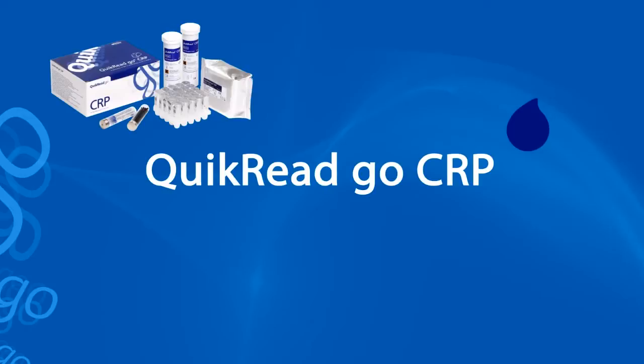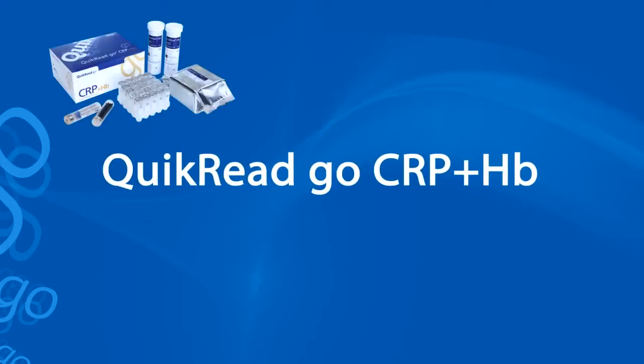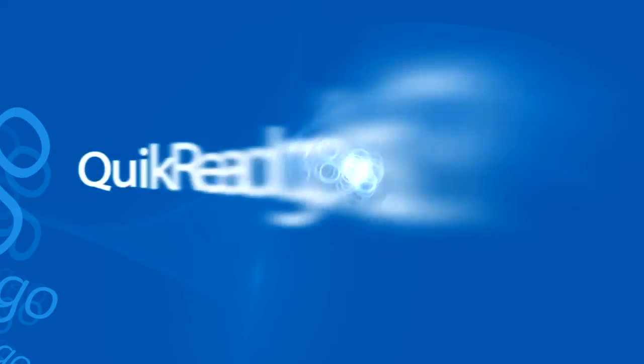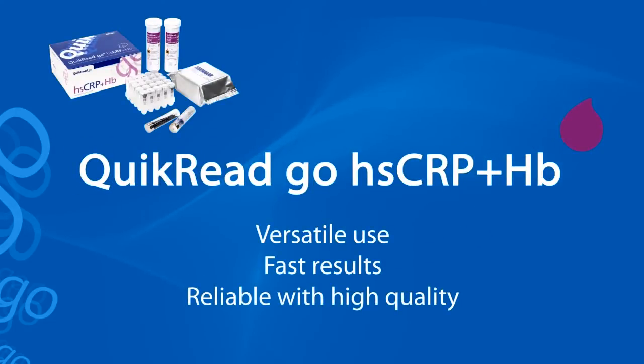With the Quick Read Go CRP test, you can measure CRP quantitatively from whole blood, plasma and serum samples. The Quick Read Go CRP plus HB test gives you both CRP and hemoglobin results from one whole blood sample with one analysis. The Quick Read Go HSCRP plus HB test is intended for situations where low CRP values are of interest.